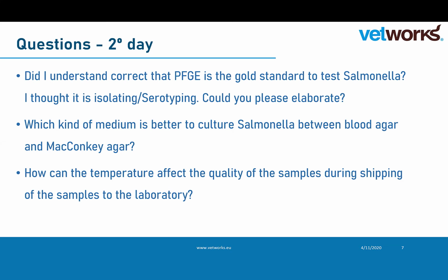Well, I think the gold standard for serotyping is still Kauffmann-White, but with this technique you can go further than serotyping. You can even say that on a farm where you find Salmonella Enteritidis, you can see if it's all the same strain. It's going further than just serotype; they're all Salmonella Enteritidis, but it's more a genotyping, in fact. On one layer farm you can have several strains of Enteritidis, and with this technique you can find out if there are different contamination routes.